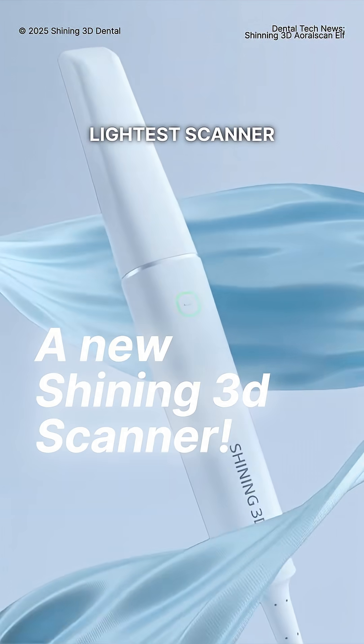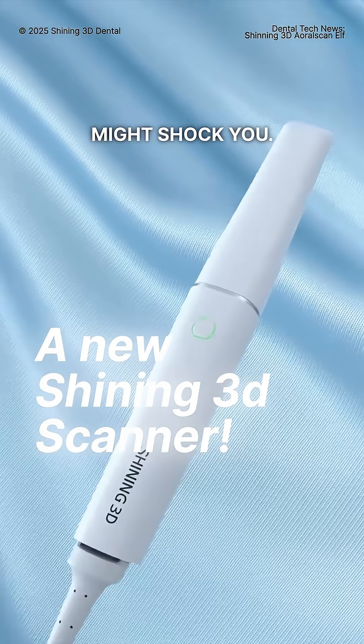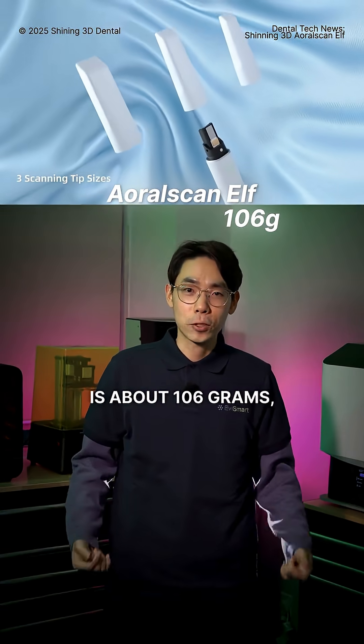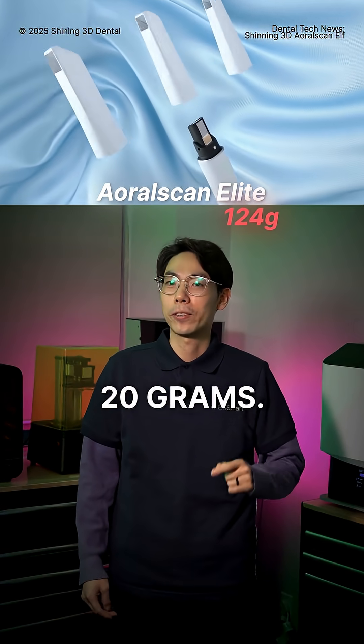Shining 3D just released the lightest scanner on the market, and its price might shock you. The newly released AeroScan ELF is about 106 grams, lighter than the AeroScan Elite by about 20 grams.